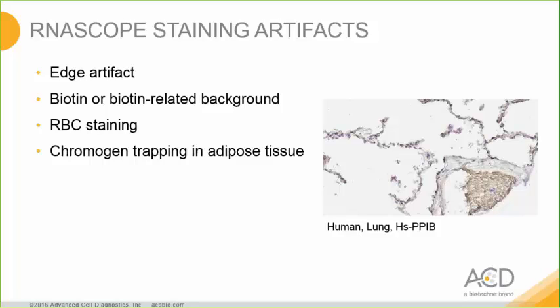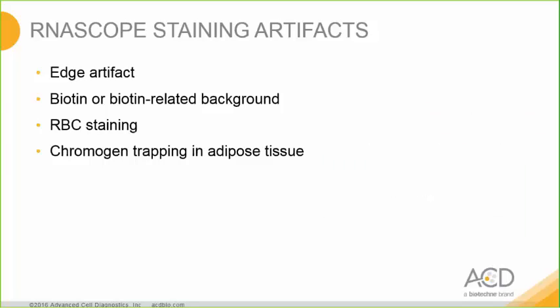This is just to show you what red blood cells look like with RNAscope. Here is a blood vessel in lung tissue that is filled with golden stained RBCs. And finally, I wanted to mention that you may encounter red chromogen trapping in adipose tissue. I apologize for not having an image to show you, but this is not true signal, as the red chromogen will be very finely granular as opposed to punctate dots seen with true RNAscope signal.